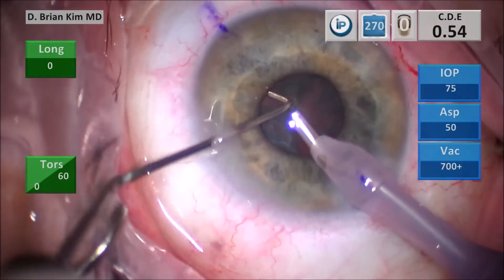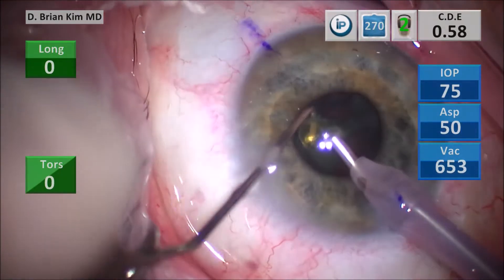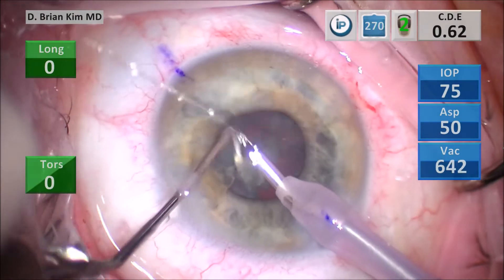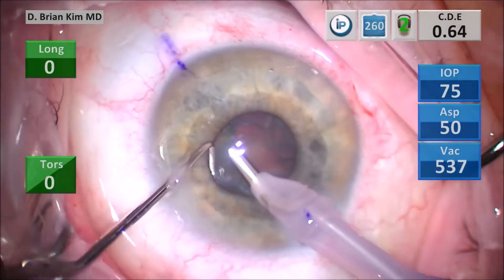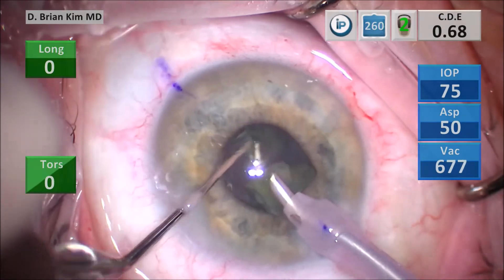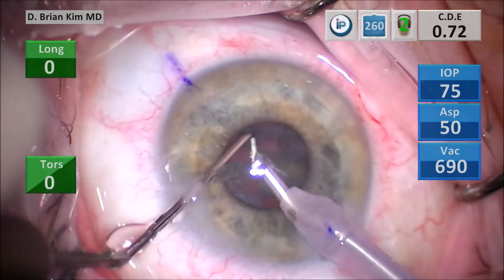Why do I want to do this? If you can minimize ultrasound and vacuum, you can provide a safer surgery. And if you can perform a technique that's consistent throughout a wide range of lens densities and pupil sizes, it can streamline your approach and make your surgeries a lot more efficient and consistent.